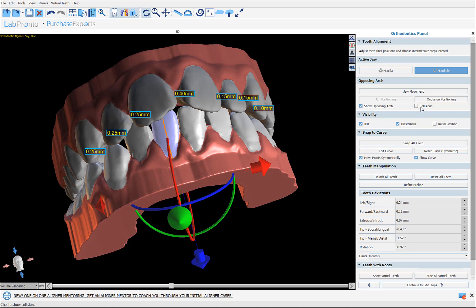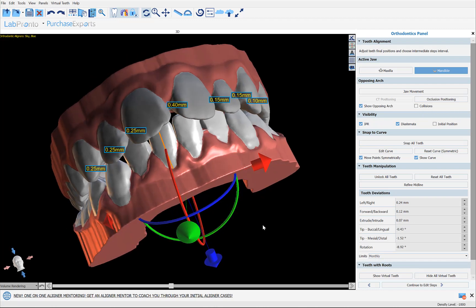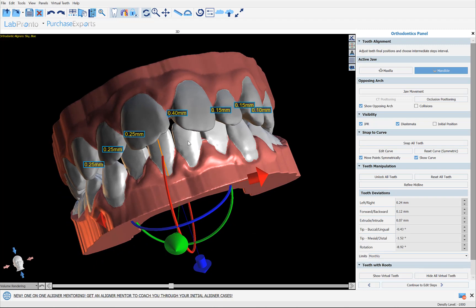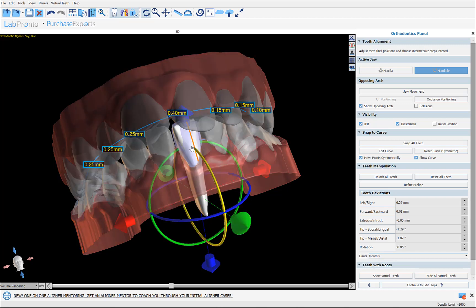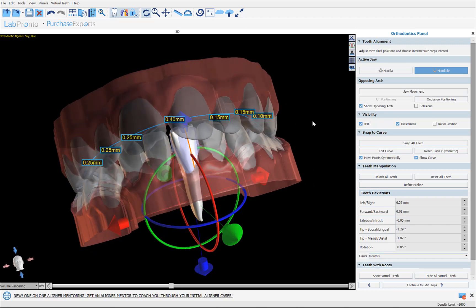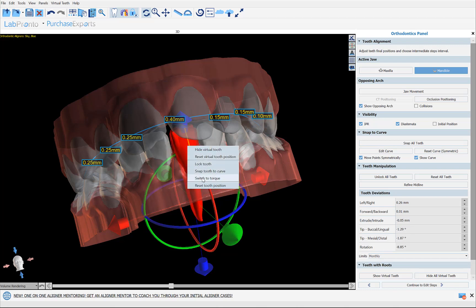We also have improved collisions functionality showing collisions between teeth in real time — just check the collisions checkbox to visualize them. Some specific tooth functionality has been moved to the right-click menu on the tooth. If you want to switch to torque, simply right click and choose Switch to Torque. Additionally, if you want a virtual tooth visualization — an estimation of how a tooth with its root would look without a CT scan — right click and choose Show Virtual Tooth.